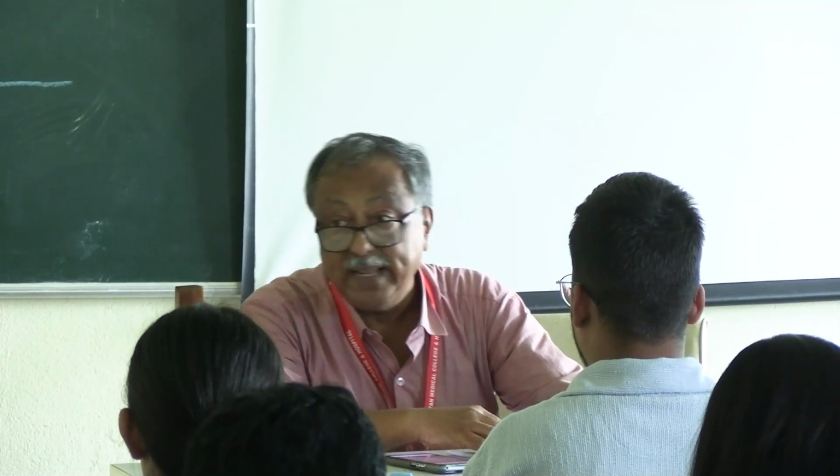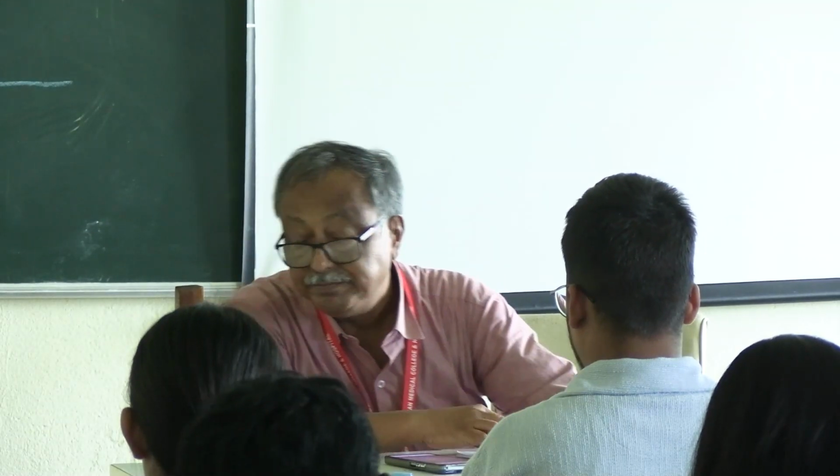Now, what is the Weber test? Madam? Anyone? Tuning fork has three parts. What is the prong, stem and the base. Base.